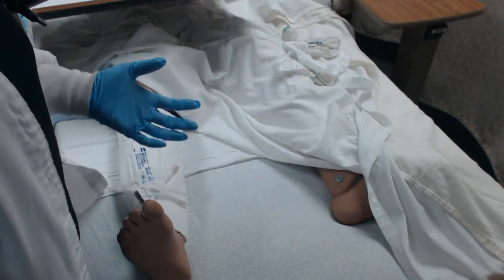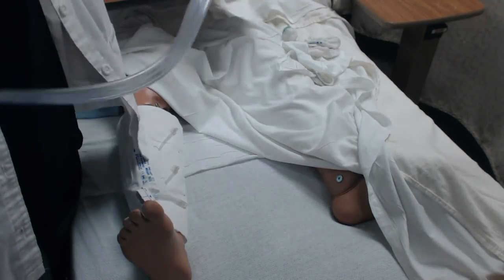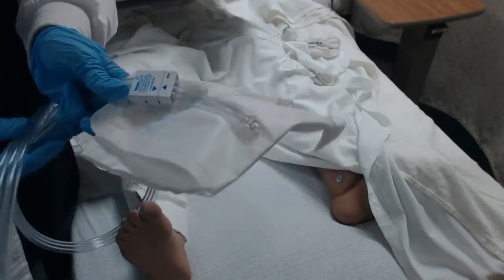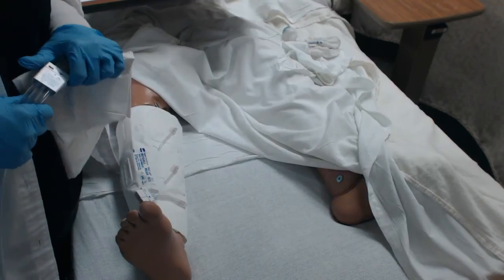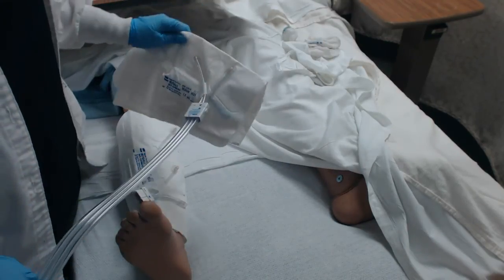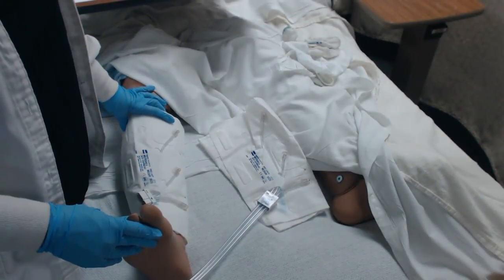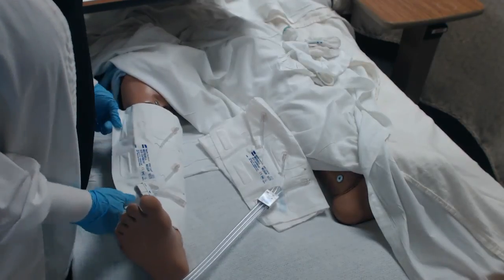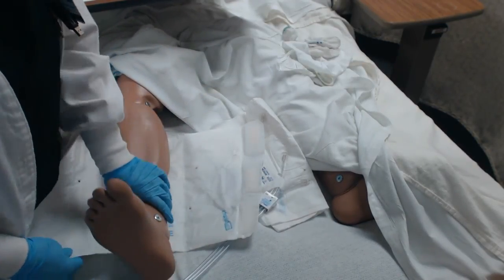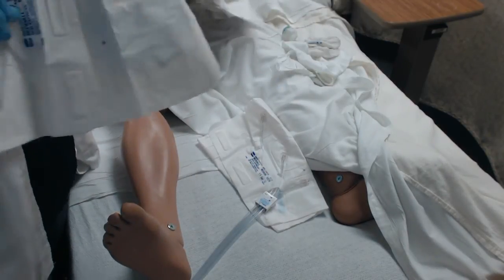So as we think, like nurses, we have to think, well, if we've got this cord attached to the patient, we have to think about what that puts the patient at risk for. So if this patient gets tangled up into these cords trying to get out of bed, we know that we're looking at a fall risk for this patient. So you have to always be thinking about that and whether or not it would be safe for that patient to wear at that time. And communicating that with the provider.